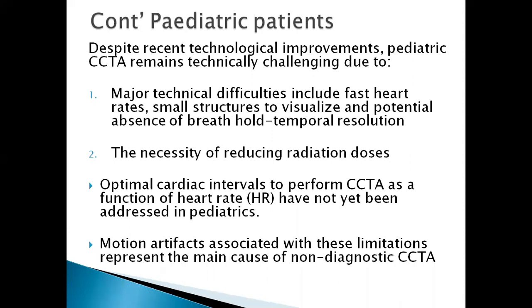They have a fast heart rate, and their heart is still very small, so their structures are very small to visualize, and they are also unable to hold their breath, which greatly affects the temporal resolution. So even if you go ahead and do this, most of the time you find that the diagnostic value of the images is not so good and doesn't provide much information. Thereby, you're just irritating the child.